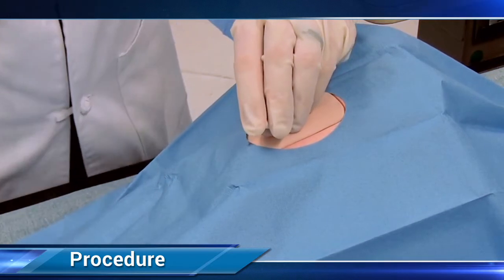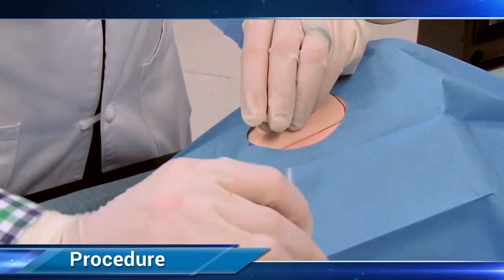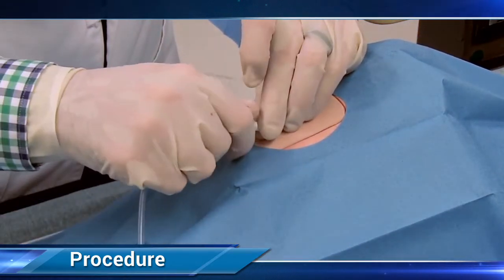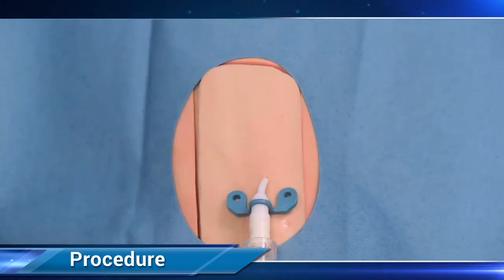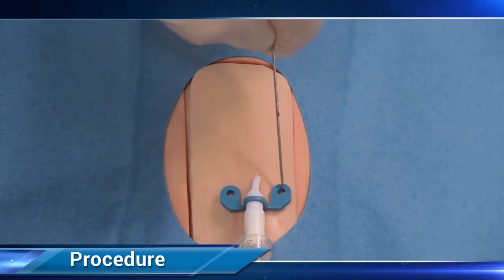Remove the needle and wire, and in a real patient you should see bright red pulsatile arterial blood. Connect your pressure tubing and securely suture the catheter and cover with sterile adhesive dressing.